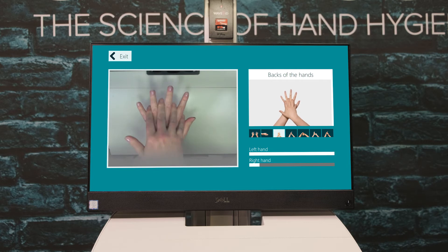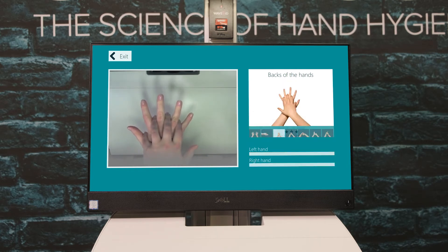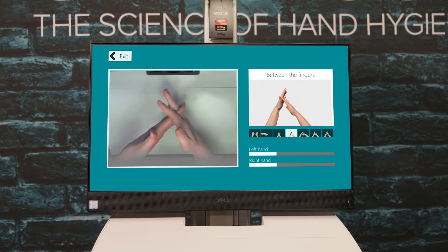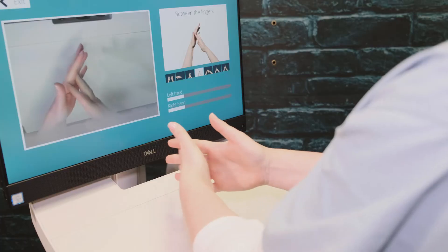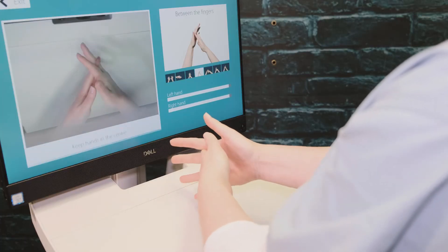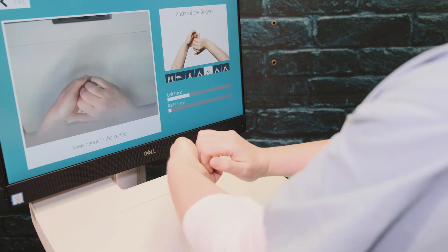In some levels, you will be shown a video to guide you and you will have a short break between poses. If you are having difficulty with a pose, make sure to follow the instructions that are displayed on the screen. The pose order will be the same every time you practice your hand hygiene. This repetition helps to build your muscle memory.